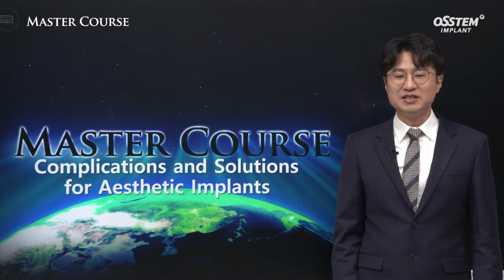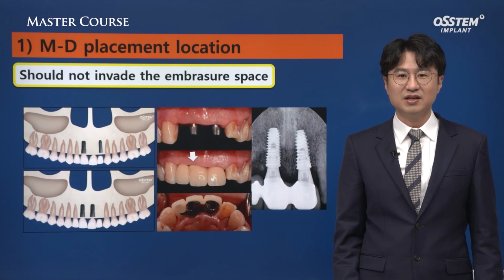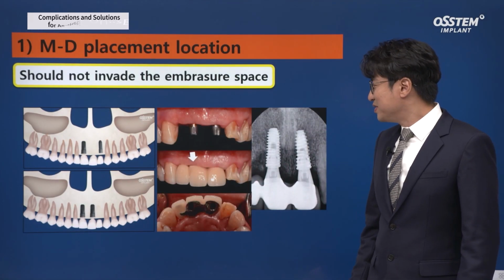Complications that occur in the aesthetic region are not easy to address, so we need to diagnose and place implants considering many different factors. We always try to do our best, but let's talk about how to overcome the complications that occur.